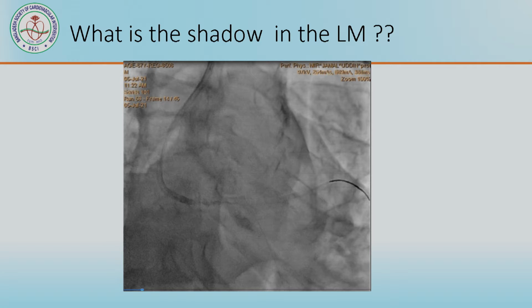If we see from close, then we see that there is a ghost shadow in the left main. And because it is far away from our chairpersons, I do not know whether they are seeing it.